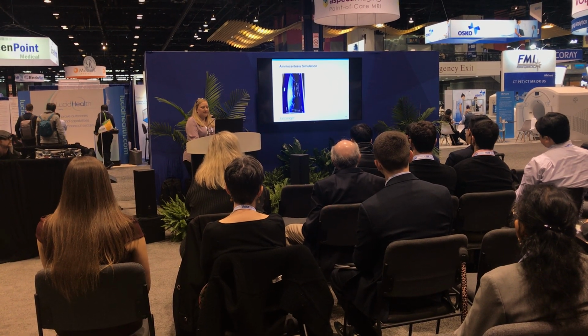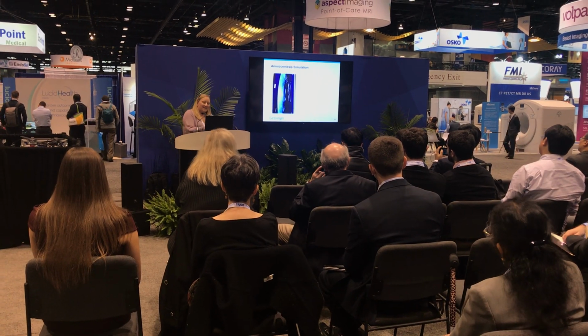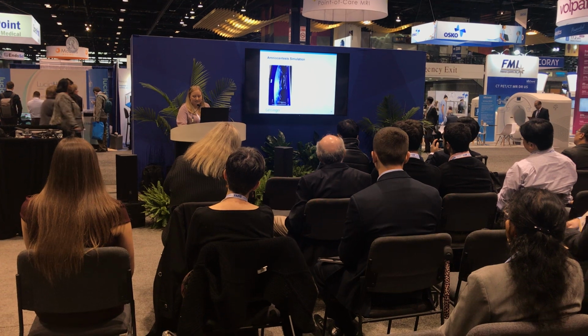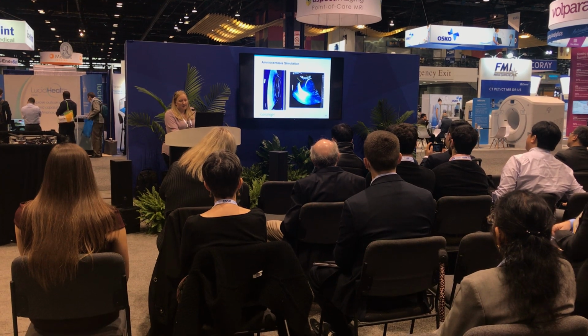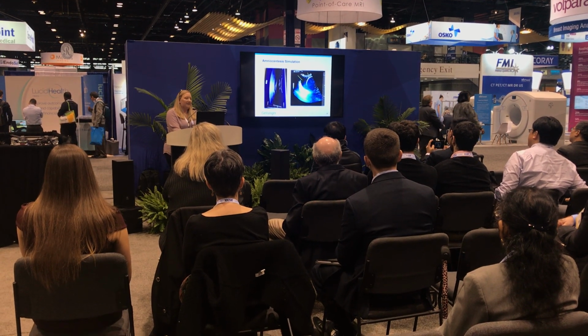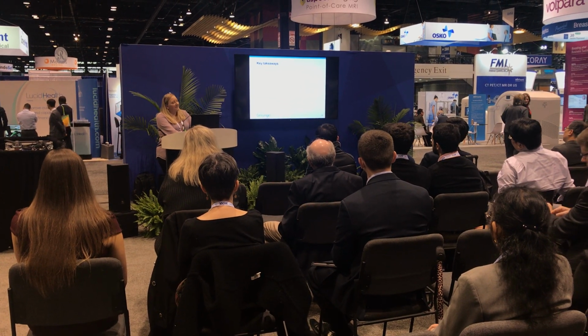When we were working on this model, and I'm sorry, I don't know why these are all coming up sideways, this is a small scale of the amniotic sac as the ultrasound tech is compressing. And this is actually where we are now. We have something that shows almost like a fetus skull in the amniotic sac itself. So we're getting there.